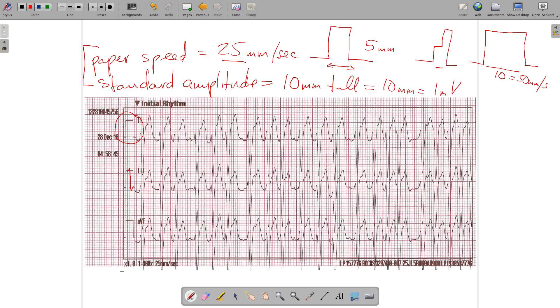The three markers on the tracing — gain, frequency response, and paper speed — confirm the calibration. The gain of times 1 means standard amplitude of 10 millimeters tall equals 1 millivolt. The frequency response here indicates electricity between 1 and 30 hertz is allowed onto the paper. Always check the gain and the paper speed to confirm the EKG is calibrated to the rules you're about to apply. If not, re-obtain the EKG at standard settings to avoid false positives or false negatives.